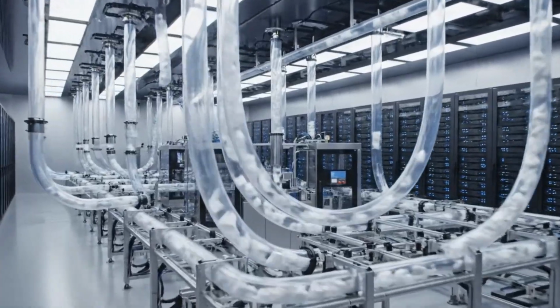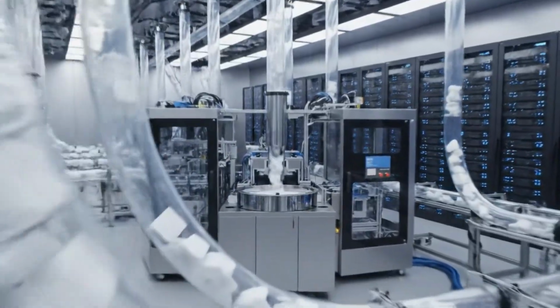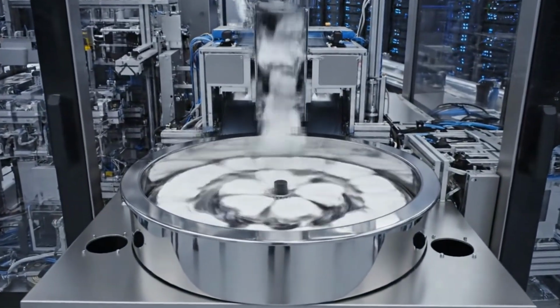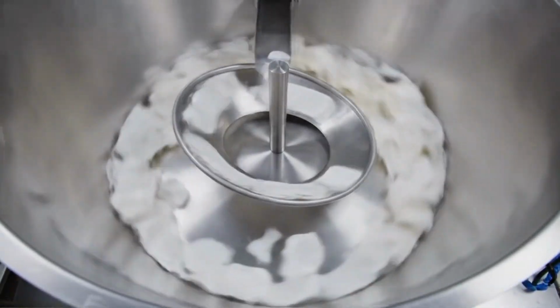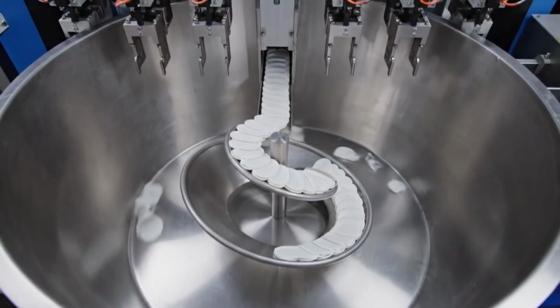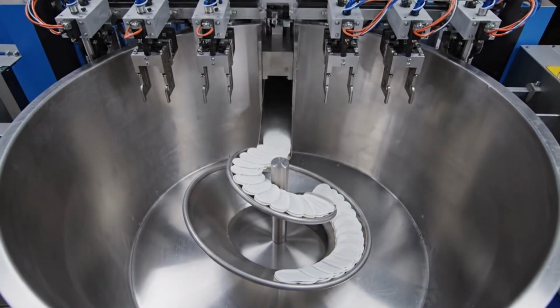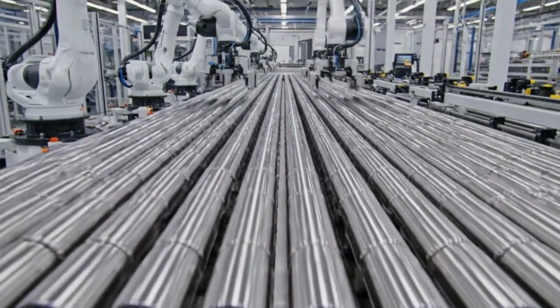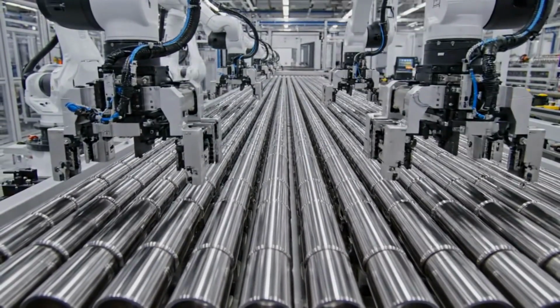In this hall, every single condom must face its most difficult challenge. There is no room for error. Organization is the first step of the test. The machines must pick up each condom with surgical precision. These steel rods will act as a human substitute, testing the rubber under extreme conditions.